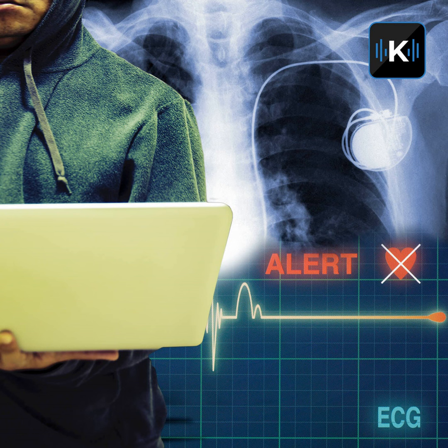So our solution was very simple, actually. It was just to enable the Windows embedded firewall. This is a Windows embedded operating system, so we enabled that firewall and blocked all inbound traffic. That mitigated the risk, because if a device in the hospital network could not connect to this device, then it could not exploit the device across the network. The device did need to be networked for outbound traffic, but not for inbound. So that was a simple fix, and that was deployed throughout the world, basically. So it was a worldwide operation, a global deal, not just a local one.